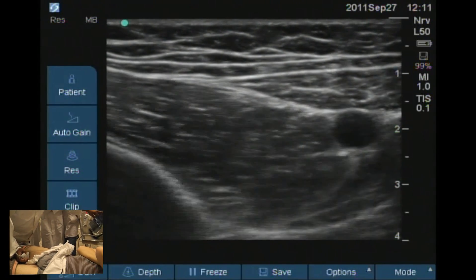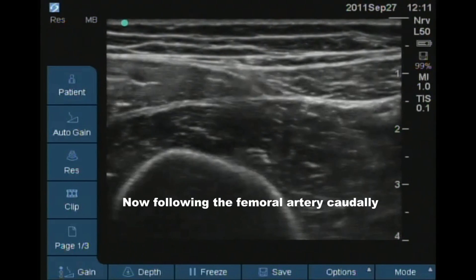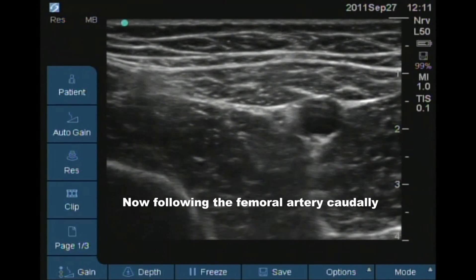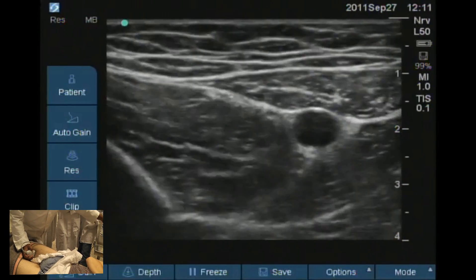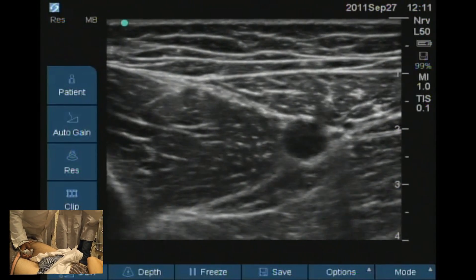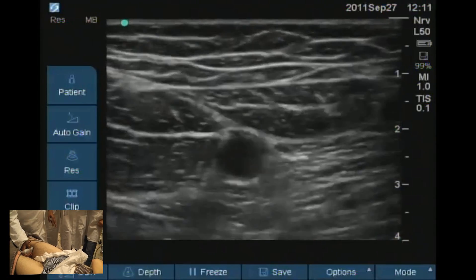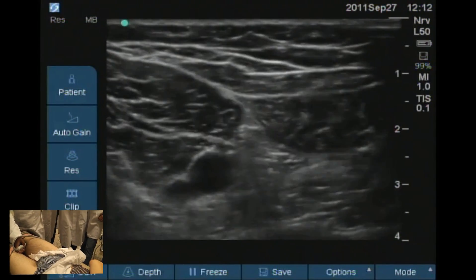The muscle appearing there is the vastus medialis. You can feel that the adductor magnus is becoming thinner and thinner because it is going to form the adductor hiatus. Your vastus medialis still looks the same and your sartorius is getting more and more flat. If you follow it all the way down, you get a bit more detail.